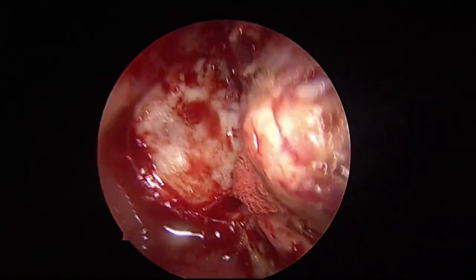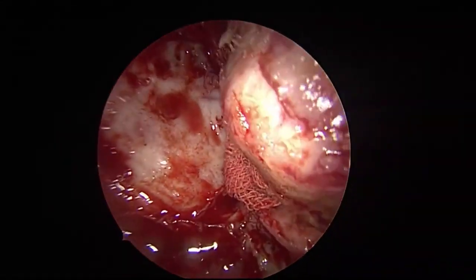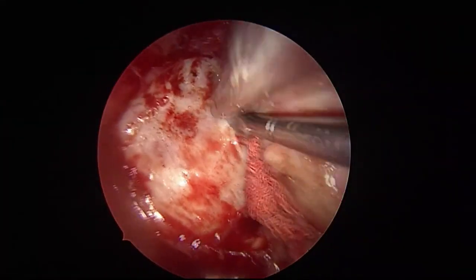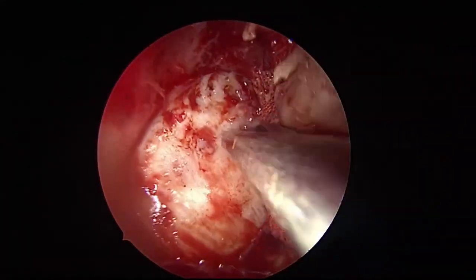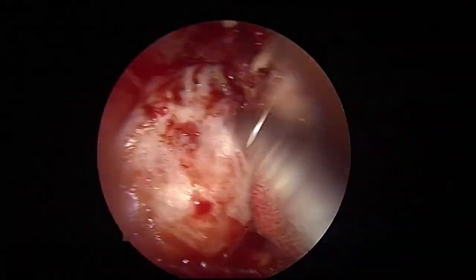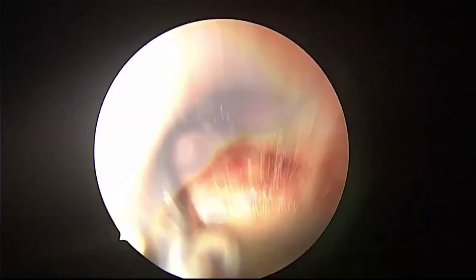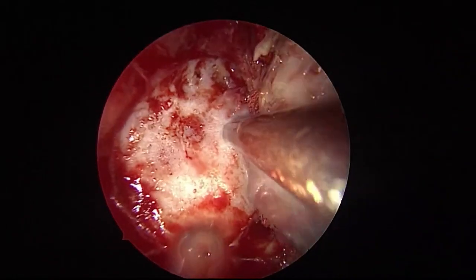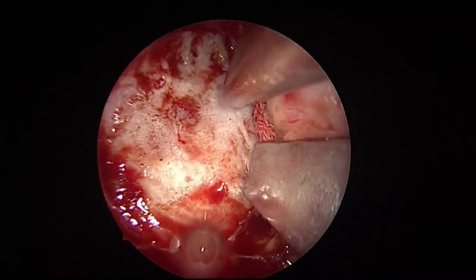I push with a gauze. See, now the entire posterior wall is in front of you. It was otherwise so difficult. So see, this is the posterior wall. It looks thinned out. This bone is thinned out because of the tumor mass pressure coming from behind. Can you see? Yes, sir. I'm cracking this bone, gently.